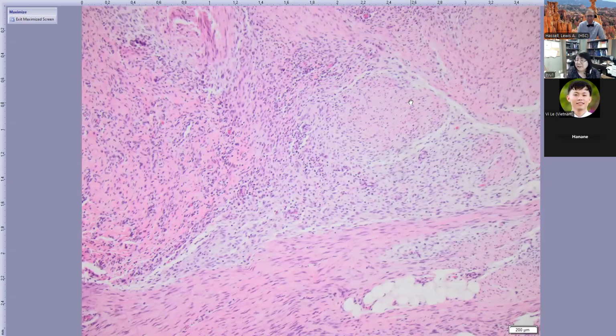Right now, there are some genes, probably like EGFR mutation. If you have trouble, if the lesion is large and you are not sure, you can run NGS. Recently, they found EGFR exon 20 insertion or duplication can be found in this tumor. So if in doubt, do NGS testing. Majority of the time it is small, you do not need it.